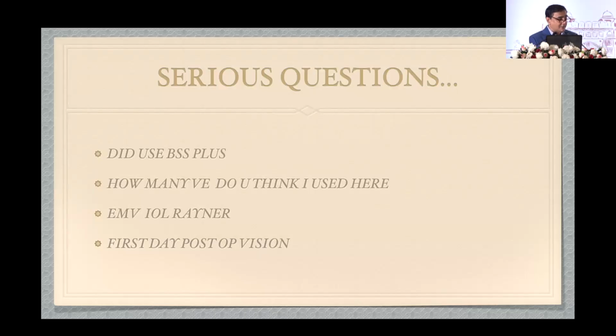So what do you think was the first day post-op vision? Basically, he must be listening to your talks. Vision was 6/6, obviously in Kumar's hand. Yeah, so that's correct. The patient was very happy.